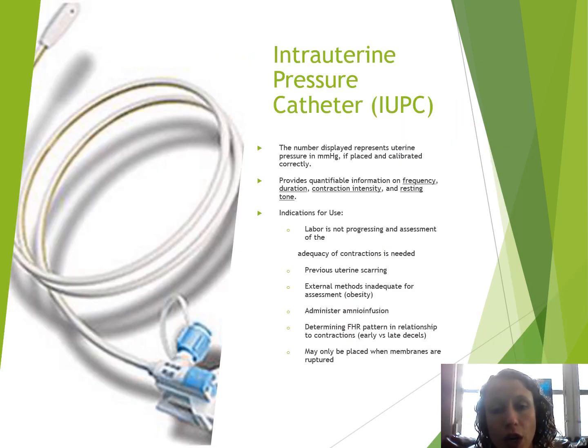So this is just a picture of our intrauterine pressure catheter. Remember, this is the internal monitor that we use to be able to measure the strength of the contractions, okay? With this, of course, it is invasive, like I was saying. We would only do it if we really needed to see how strong those contractions are. Sometimes we might do it if we need to have a really good read of the contractions. If we wanted to do things like an amnio infusion, we would need to have an IUPC in place, okay?